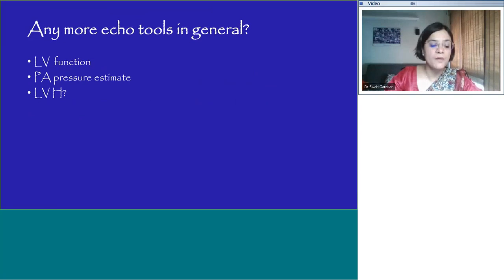Remember what I said about diastole, the relaxation components being energy dependent, and if energy is impacted, supply of energy, and it's affecting your systolic function, it's definitely going to impact the diastolic function as well. So better you start, you know what the systolic function of the ventricle is before you get into evaluating diastolic function.